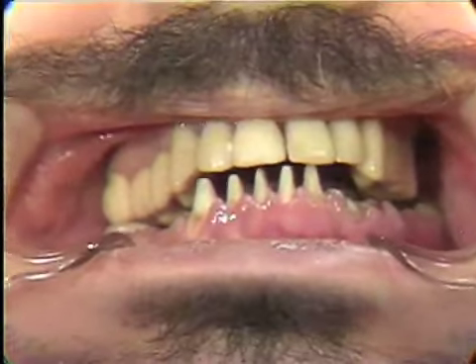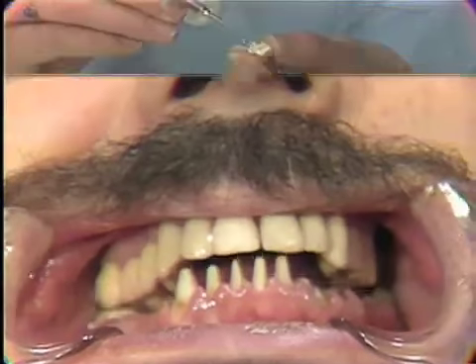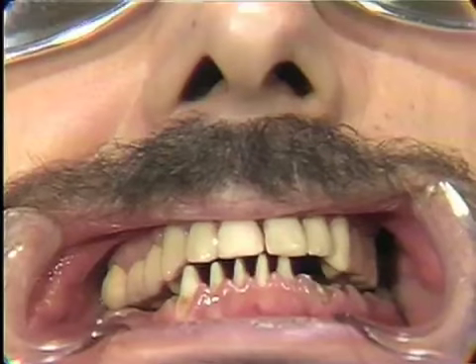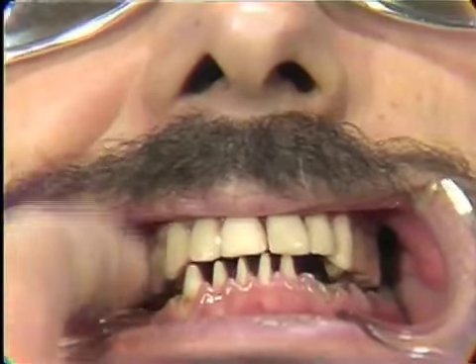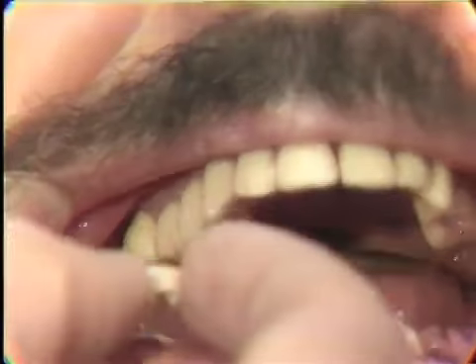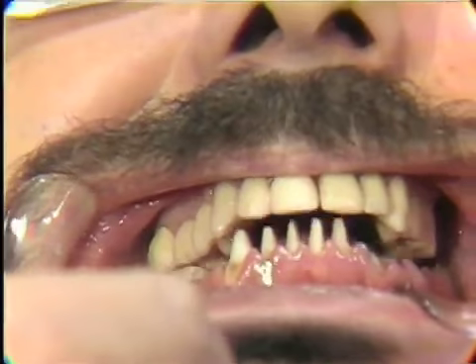Close, please. Bite down, and use the opposing occlusion to seat the temporary. Now, if we were going to seat the full mouth of temporaries again, we would seat opposing quadrants of temporary so that the occlusion can be used to seat the temporary in place. Open please. Close, tap, tap.